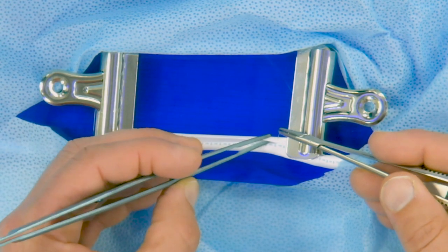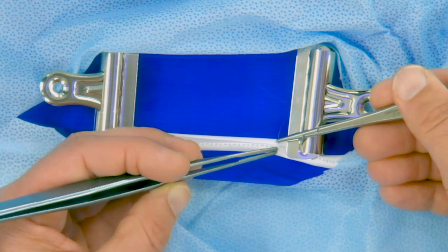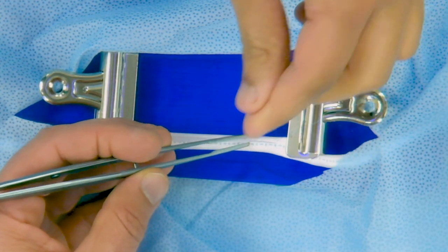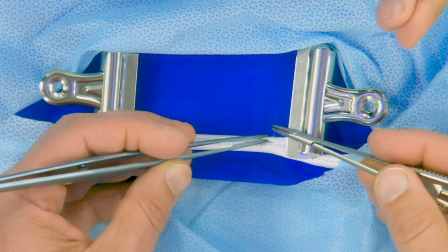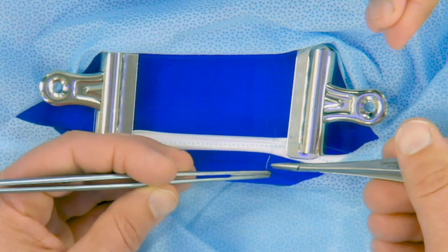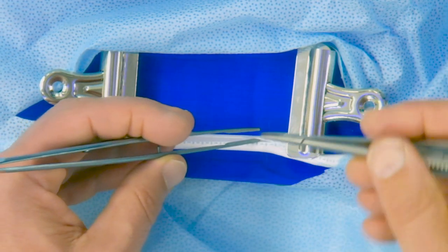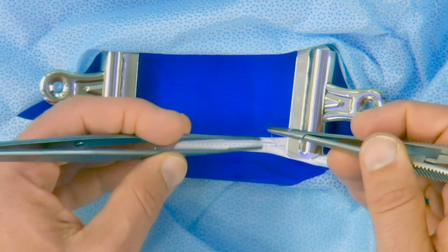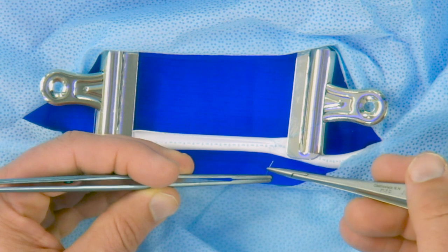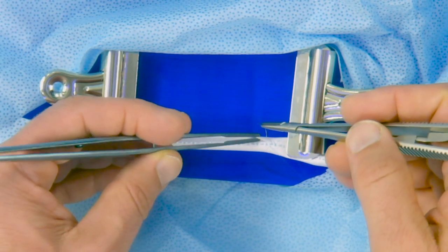Start with a simple forehand throw, loading the needle properly, and taking small, equal bites on each side. Note that with each grasp, the needle is adjusted to have the proper orientation to prepare yourself for the next bite. Note as well that all the action with the needle and the needle driver happens in the field, not off the field. Meaning that the needle is loaded here, adjusted, and then pulled forward rather than happening off the field.